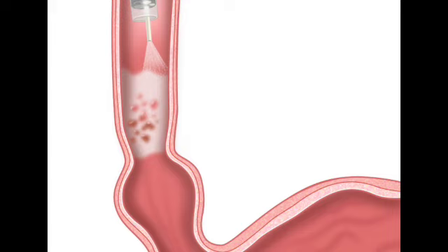Yes. The source notes that the dysplastic epithelium either doesn't take up the whitening as well in the first place, or it loosens and loses the aceto-whitening rapidly compared to the rest of the healthy columnar lining. Right, columnar lining, like literal columns. Yes, actually. The healthy cells in this specific area are structured neatly, stacked side by side like tiny columns. Wow. Because they are orderly and structurally sound, they hold on to that chemical reaction. They maintain the protein shift that keeps them looking white.